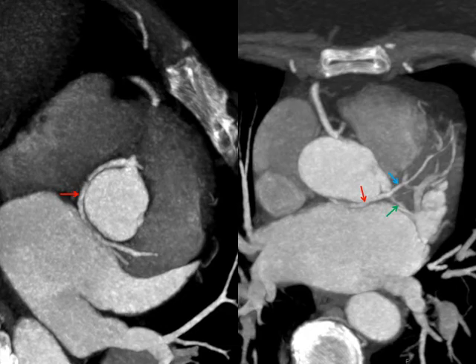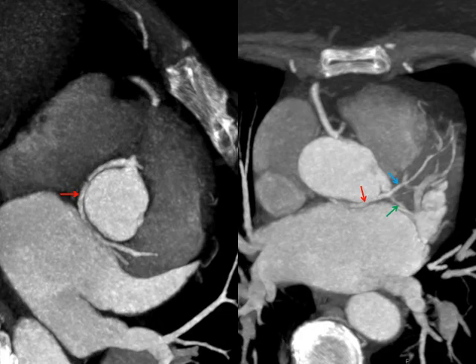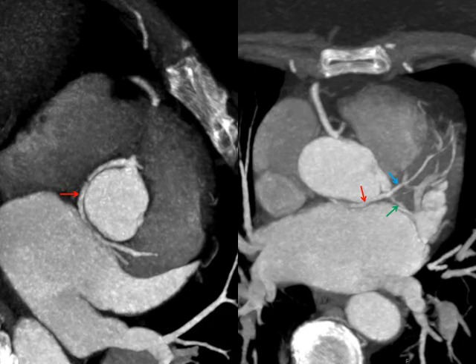Curved MIP images track the retroaortic course of the anomalous vessel, which can now be identified to be the left main coronary artery as it bifurcates into the LAD and the circumflex, labeled as the blue and green arrows respectively.